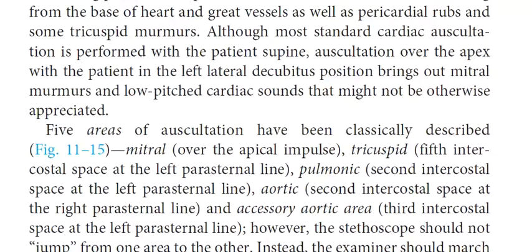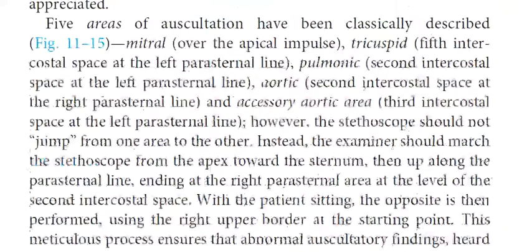Although most standard cardiac auscultation is performed with the patient supine, auscultation over the apex with the patient in the left lateral decubitus position brings out mitral murmurs and low-pitched cardiac sounds that might not be otherwise appreciated.